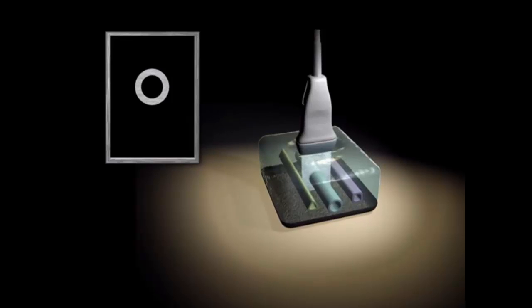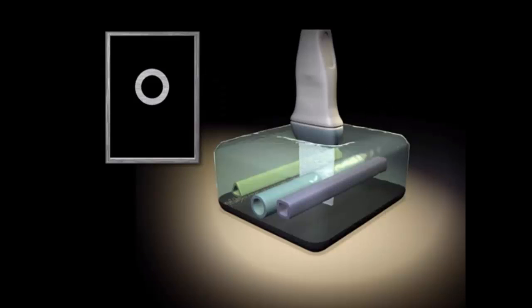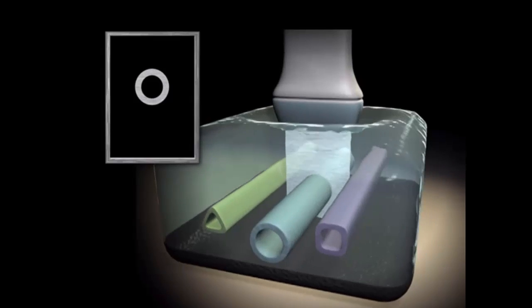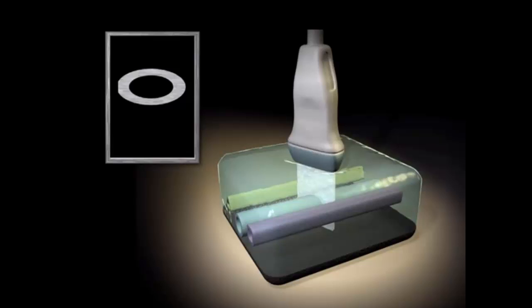First off, if we look at a short axis view, we can see how the beam is coming out of the ultrasound transducer and hitting the structure, in this case a tube-like structure like a blood vessel, in a way that it is resembled as a circle on the screen. This short axis viewing cuts the cylinder transversely to resemble a circle. If we were to turn the probe lengthwise, so long axis, it would resemble two lines with a hollow lumen in the middle, as you can see now.